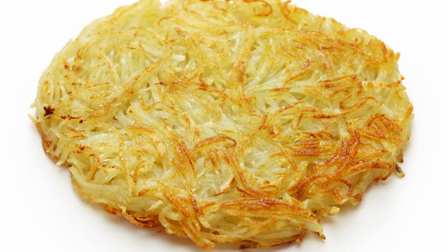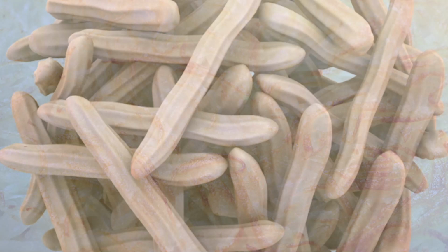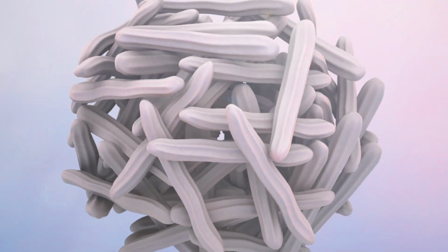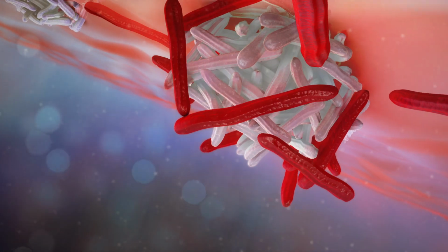If a hemostat powder had a tight cluster structure with a random lattice pattern like hash browns on my breakfast plate, it could cover a large uneven area and penetrate the blood surface and stop bleeding quickly during surgery.